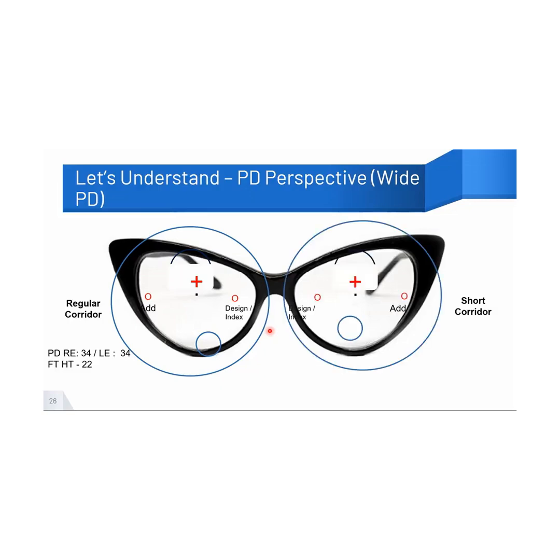So the key message here is never say no directly to your consumers, because as spectacle frames are now fashion accessories, you will have to tweak and customize designs for them. You will have to understand what could be the best possible fit for that particular frame, and accordingly select a corridor. Also, before finalizing the frame, if you find that the customer has a narrow PD, go with a smaller frame size. If the customer has a wide PD, you are blessed. You can dispense them any special frame design that you want.